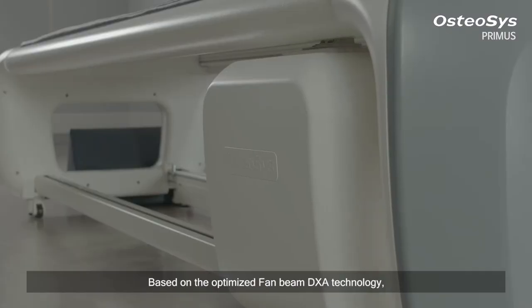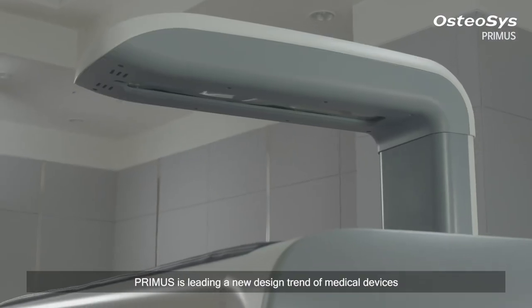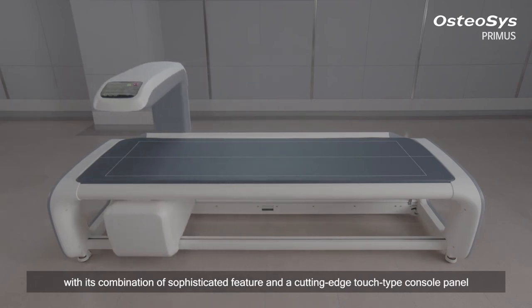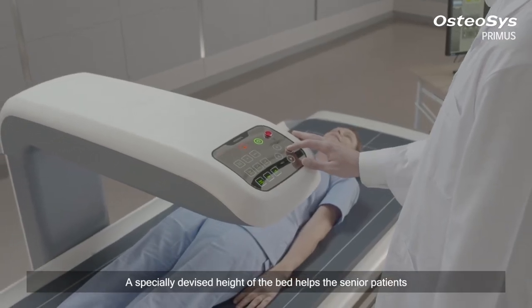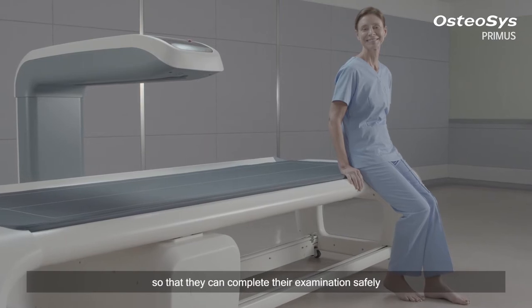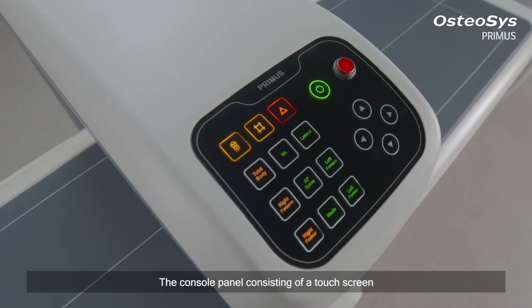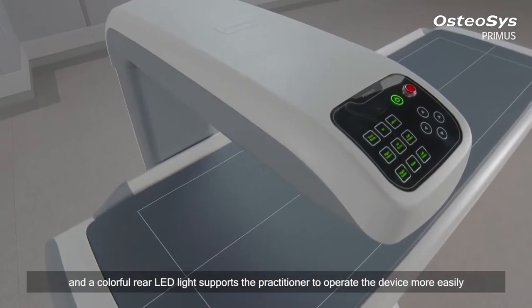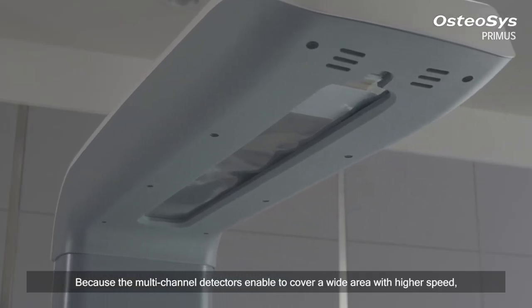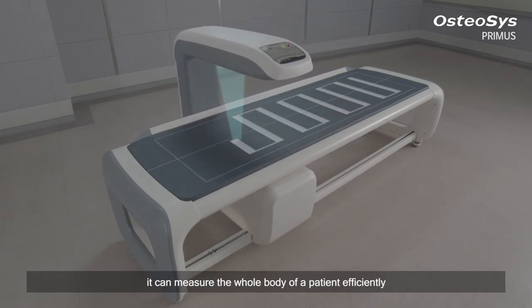Based on the optimized fan beam DEXA technology, Primus is leading a new design trend in medical devices with its combination of sophisticated features and a cutting-edge touch-top console panel. A specially devised bed height helps senior patients and those with relatively low height to lie down comfortably, completing their examination safely. The console panel, consisting of a touch screen and colorful real LED light, supports the practitioner to operate the device more easily. Multi-channel detectors enable coverage of a wide area at higher speed, measuring the whole body of a patient efficiently.